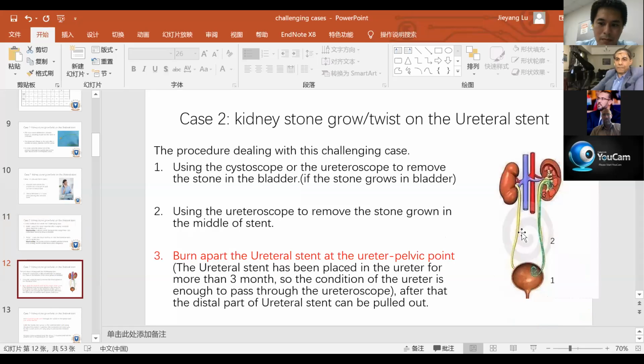In some complex cases, there are stones in the kidney that are twisted very hard. Then you need to use a third part to break apart and hit the stones inside the kidney. I think you can deal with this in one surgery, handle it for the patients, and pull out the stents in one surgery. I recommend it as the best way of dealing with these cases.